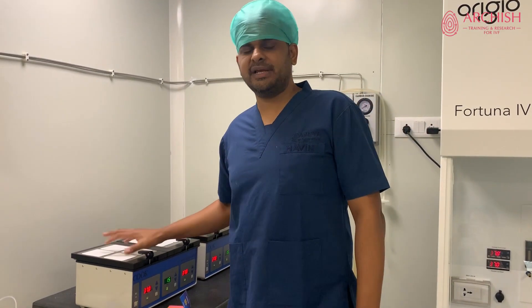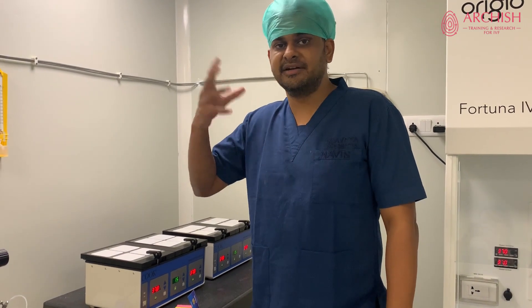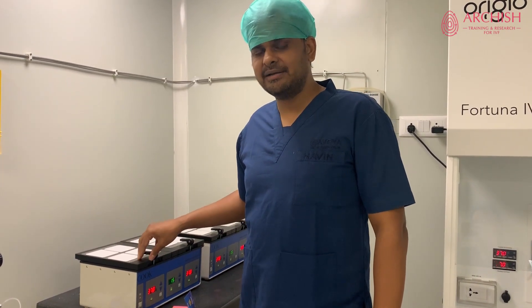The next is bench top incubators, which have two aspects. Incubators are of two types — they either run on tri-gas or CO2. The bench top incubators we use run on tri-gas, which is a combination of oxygen, CO2, and nitrogen. Every tri-gas cylinder must be certified with the proportions of the mix. Once you have certified gases, the flow will be accurate. You then use a CO2 probe to check inside and see whether it reads 6%, because if your tri-gas cylinder doesn't have 6% CO2, you won't get a 6% CO2 output.